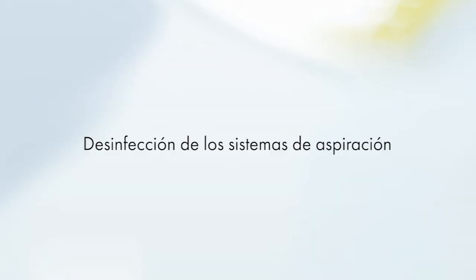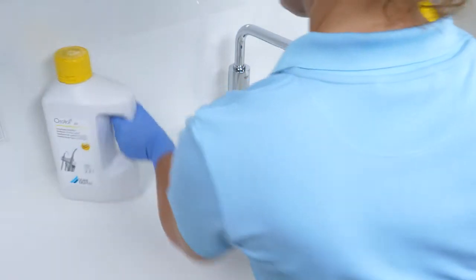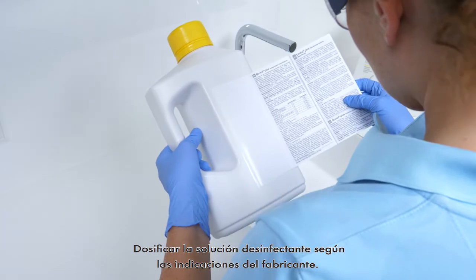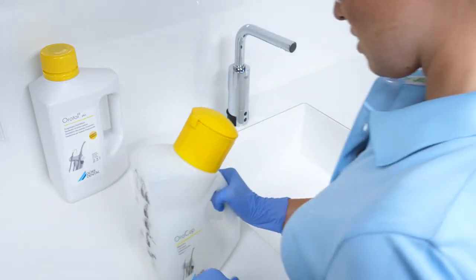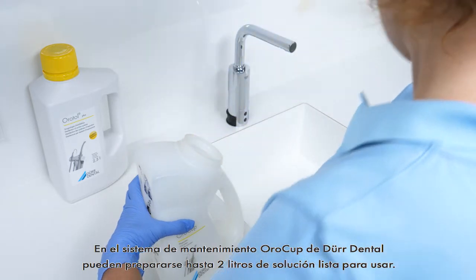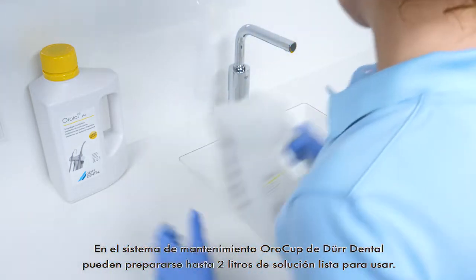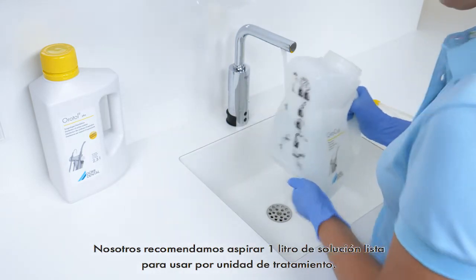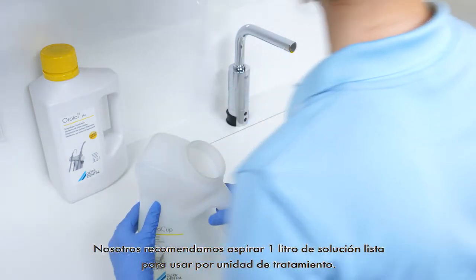Disinfection of suction systems. The disinfection solution must be dosed according to the manufacturer information. Up to 2 litres of ready-to-use solution can be prepared in the OroCup care system from Der Dental. We recommend the suction of 1 litre ready-to-use solution per treatment unit.